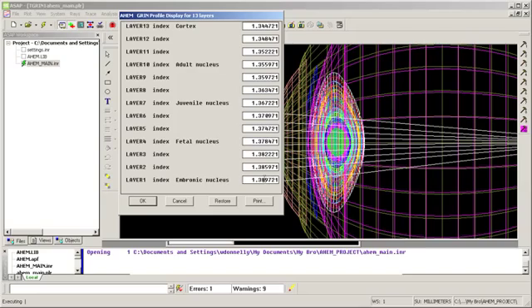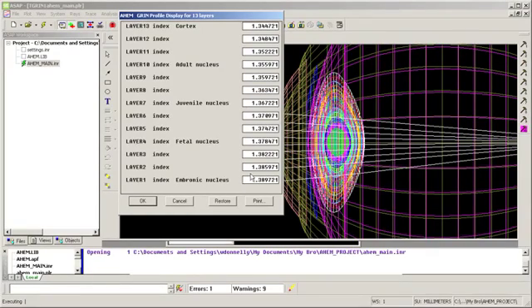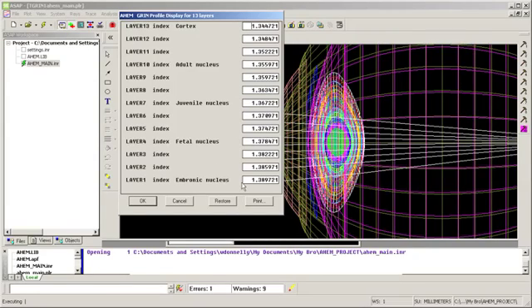And as I go outward, I've got various changes in index. So this is my gradient index lens profile for the various 13 layers of this lens.